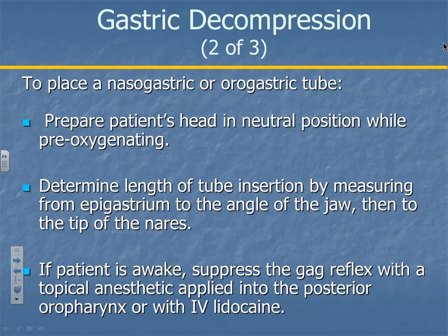Okay. Lots of times a patient will be brought to the ER because they've taken some drugs. I'm going to kill myself. I've taken all these drugs. And they haven't killed them yet, so they're still sitting up, so they want to suck all that out of their stomach. That's one of the things that they do. Same type of procedure when we are decompressing the stomach. We're going to slide a tube down their nose and into their stomach.